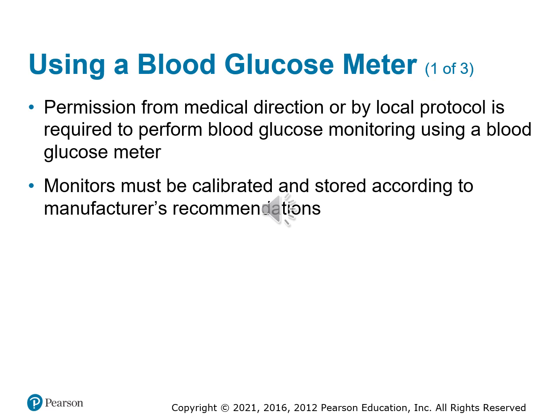Again, this is one of those things that's got to be in your protocols. You need to get permission from your medical direction to be able to utilize this device. Very commonly it is used. These monitors do require a little bit of maintenance in the fact that they need to be calibrated. It's nothing that you can really calibrate, but there are ways that you can verify that the monitor is reading accurately with test solutions. Usually you have to log those test solution numbers.